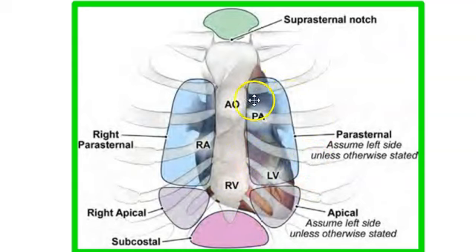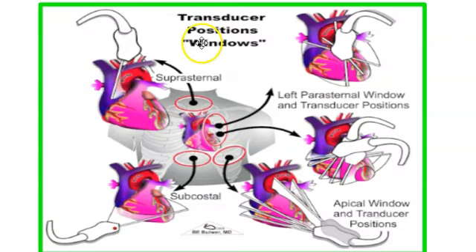We talked about what rib space we typically image the heart in, generally the third and fourth intercostal rib spaces. Oftentimes on patients we can't actually count those rib spaces down because there's just too much tissue over that, but once you get a feel of where you're going to find the heart, you'll just know where to go, so to speak. We talked about our subcostal and practiced the subcostal view today. Again, transducer position, windows, and so on and so forth.